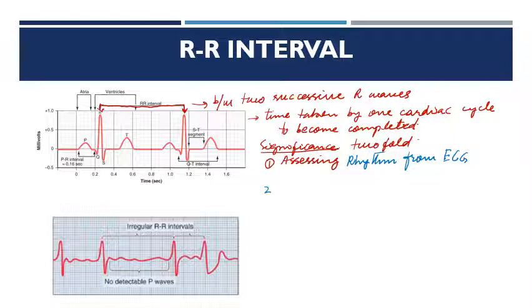Number two, it helps in determination of heart rate.